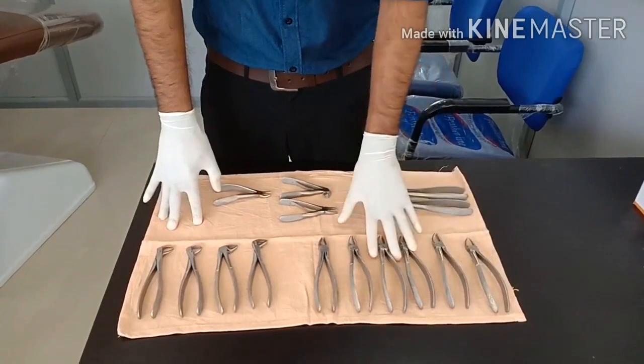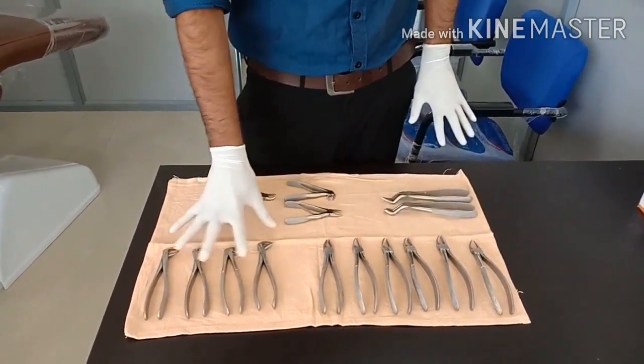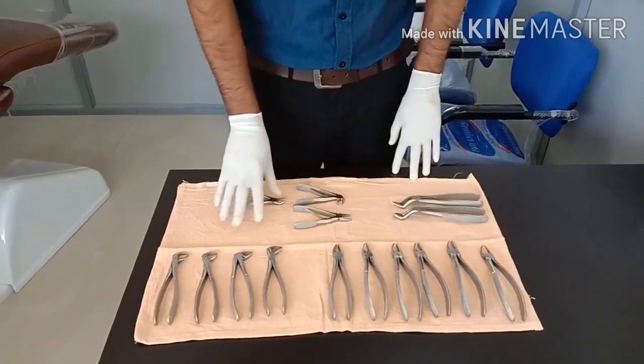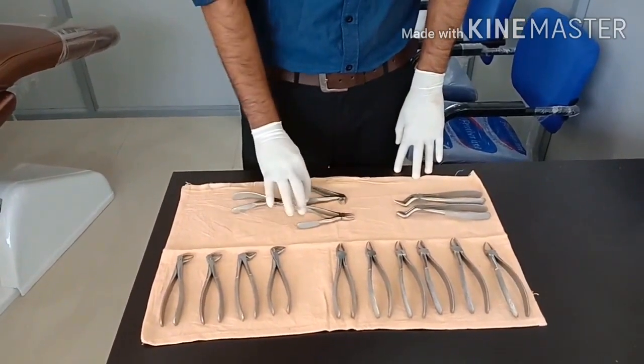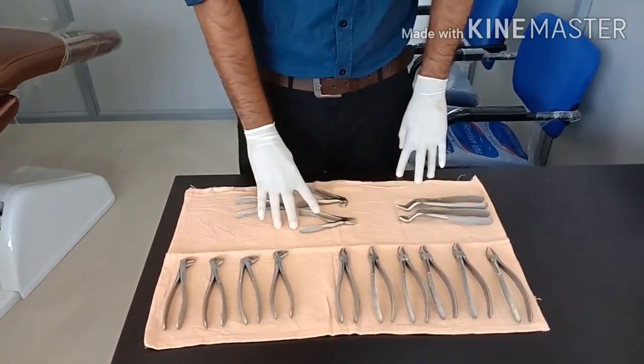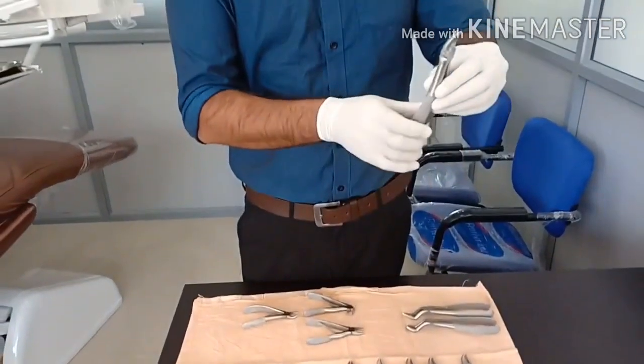On my right side are the upper jaw forceps and on my left side are the lower jaw or mandibular forceps. These three are milk tooth forceps, commonly used for kids' teeth extraction. I'll show you the basic parts of a tooth forceps.